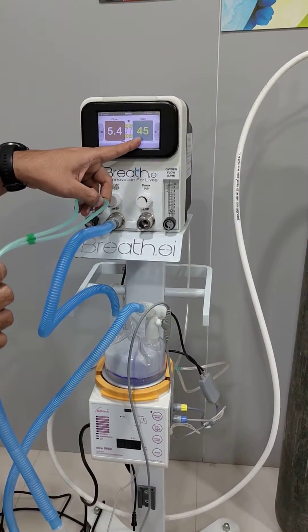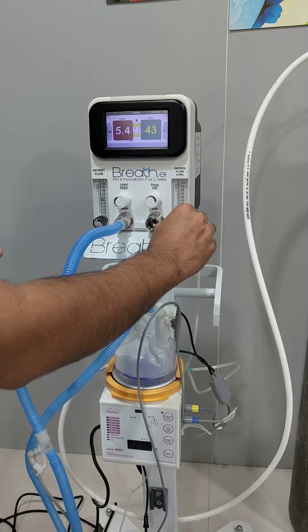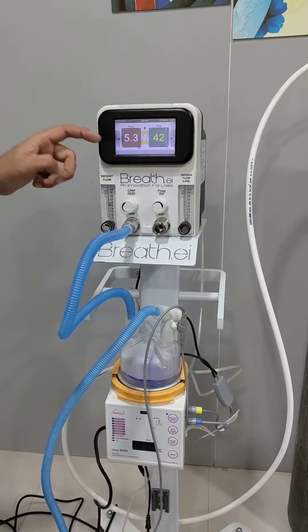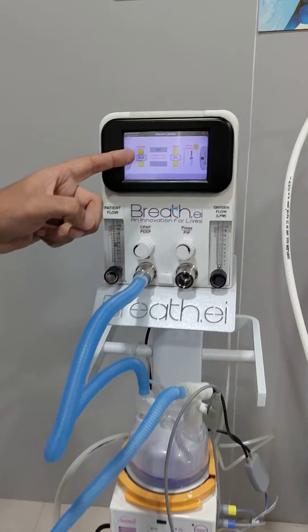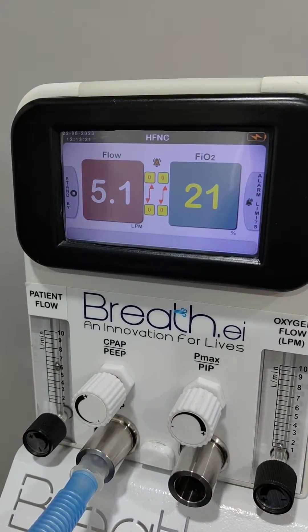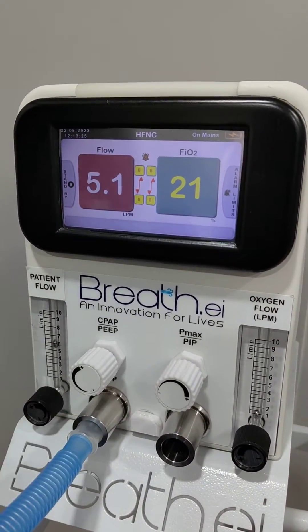We can show the flow here. If we do not require it, we can turn off the alarm. If we require to adjust the alarm limits, we can go to the menu and set the appropriate limit.